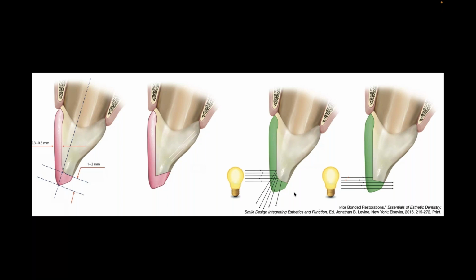In full coverage, that's a little bit different. This is more about the coping design. But in veneer world, I want to keep this effect happening. And if this is going to be in full coverage, same thing for my coping design. I want more of a rounder edge here to finish, and then the wraparound for the final ceramic.